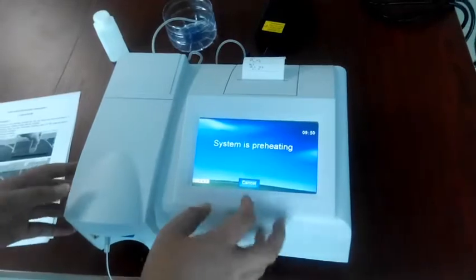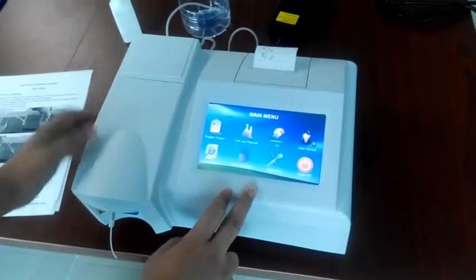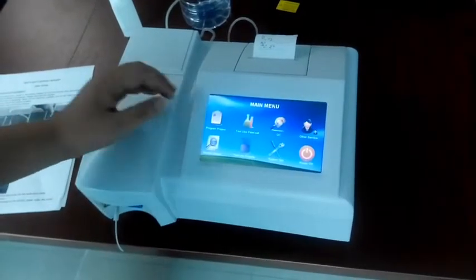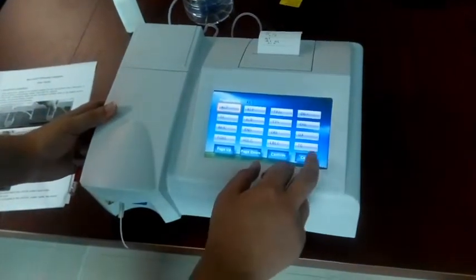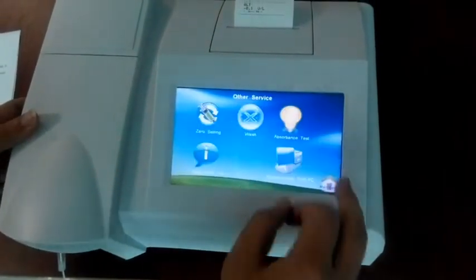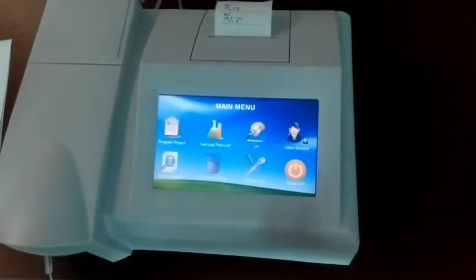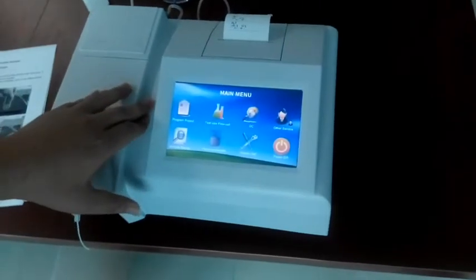Now it's the main menu and you can see item programs here. We should check each of them — click it and cancel. After checking each one, it shows that this machine is okay.